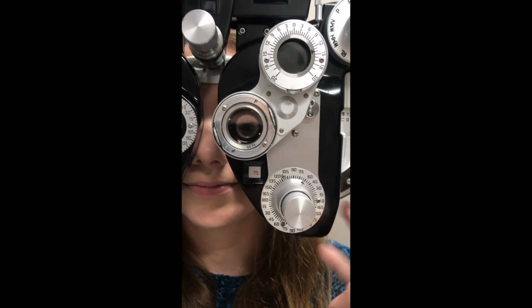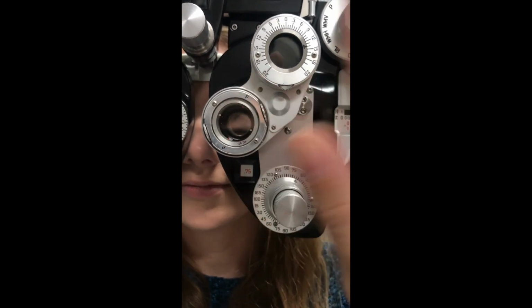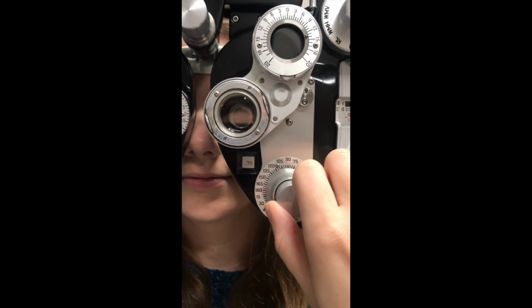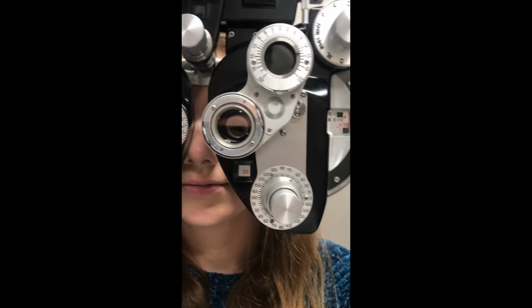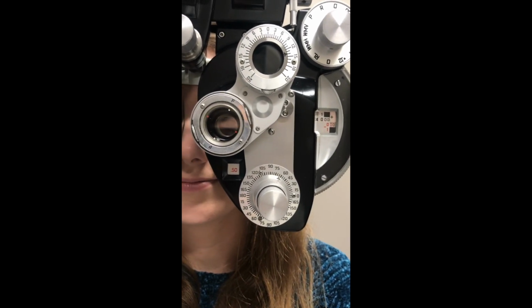Okay, Abigail, let's see now. Do you prefer option 1 or option 2? Option 1. Option 1, that is the white dot. So that means that we will go back down. She did not like that extra 0.25, and we have completed power refinement mode.